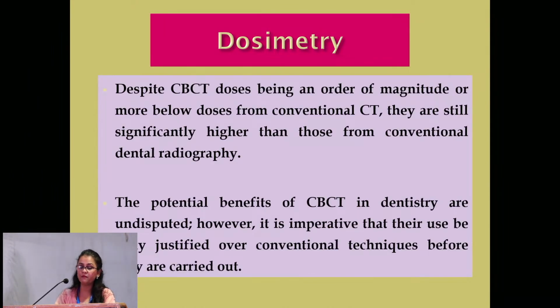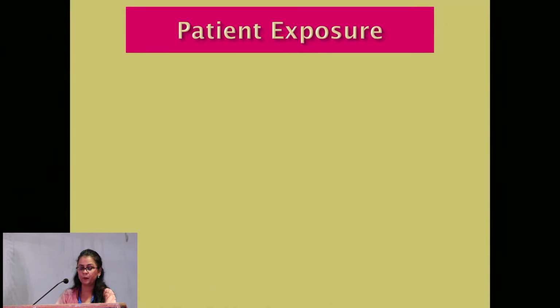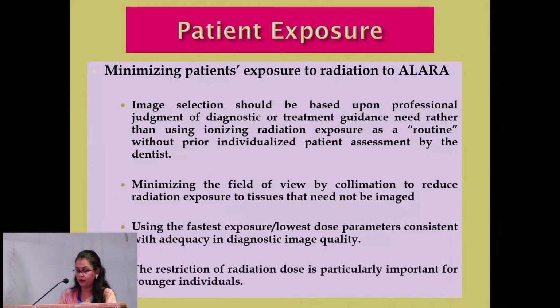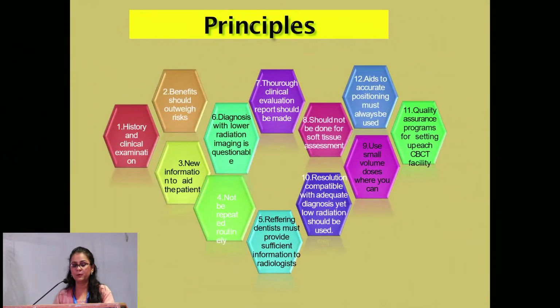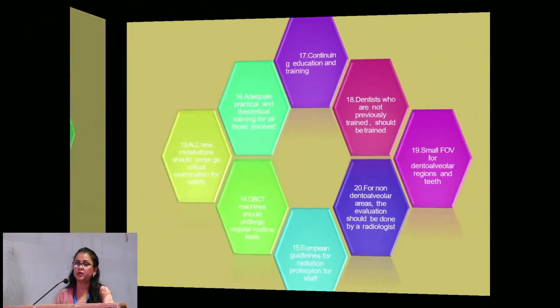So the potential benefits of CBCT in dentistry are undisputed. However, it is imperative that their use be fully justified over conventional technique before they are carried out. As I told you, there are a lot of principles that need to be followed. There are European guidelines that we have to take into consideration. Not all patients can we subject to CBCT. History and clinical examination play a very important role.